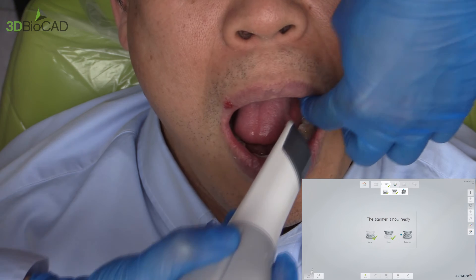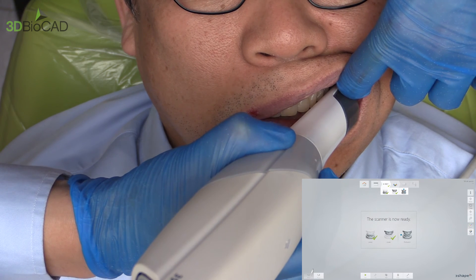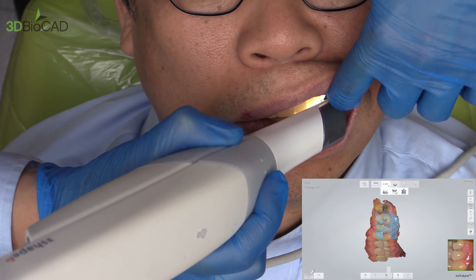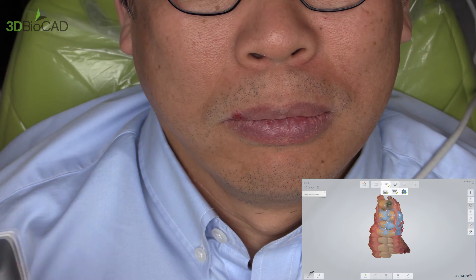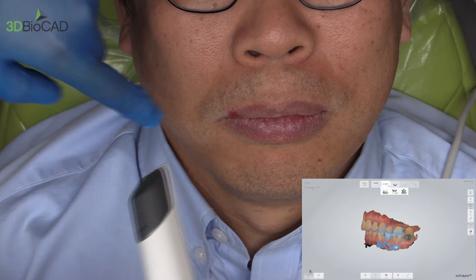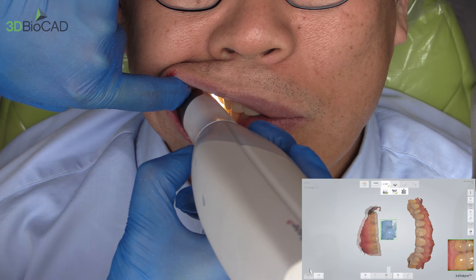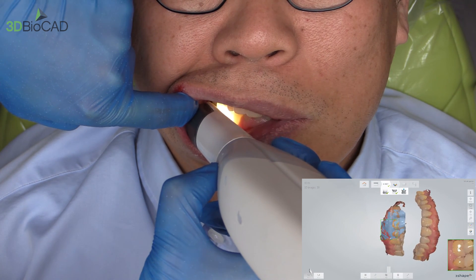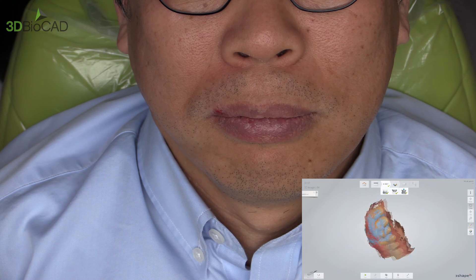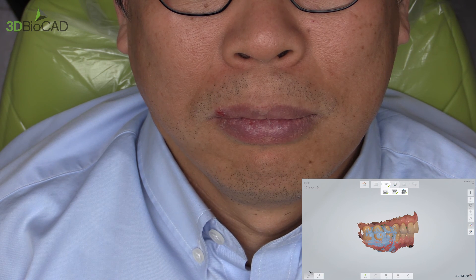Open please. Bite down. The computer is going to ask you to take a bite on the other side as well. Open please, then close the bite. Scanning 4 to 6 pieces is suitable for taking a bite of each side.